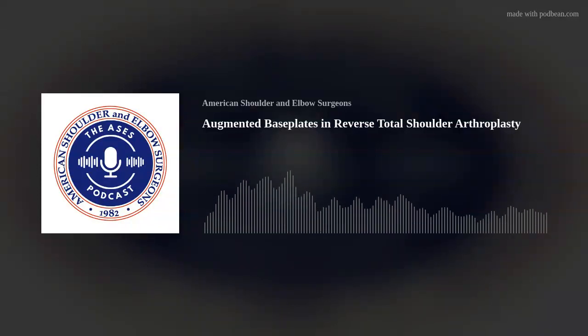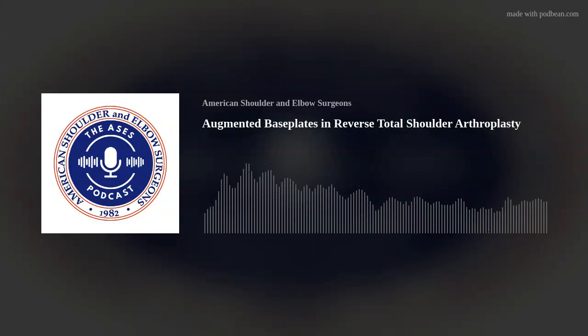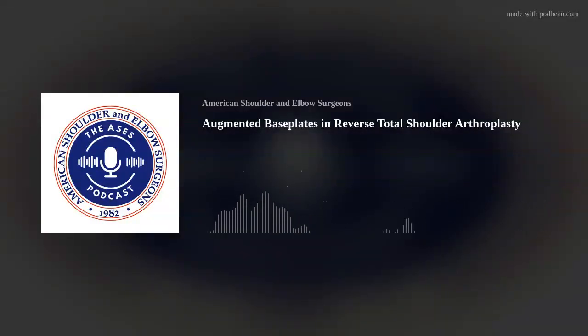They're all different, and that's what makes this so much fun, and why shoulder arthroplasty is just one of the coolest things in medicine. Every one you have to think differently and critically about. The patient that has a medialized, uncontained cavitary defect, and we all know what that looks like, there's almost no vault. Maybe there's some inferior glenoid. It's uncontained. That patient usually gets a custom for me.